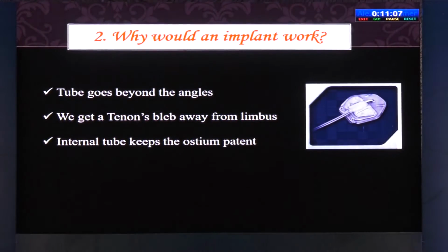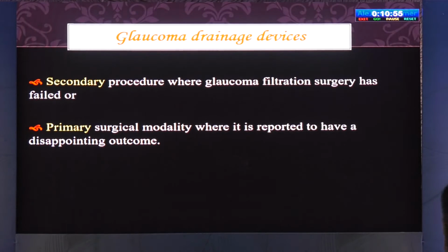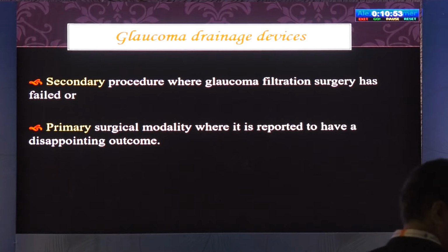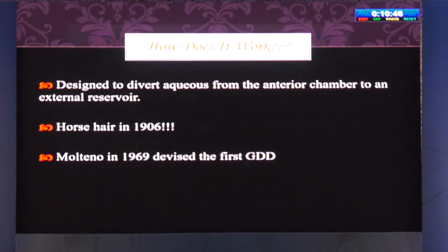Why would an implant work in such situations? It's because the tube goes beyond the angles. We get a Tenon's bleb away from the limbus, and the internal tube keeps the ostium open. GDDs can be used as a secondary procedure where GFS has already failed, or as a primary surgical modality where trabeculectomy is reported to have a disappointing outcome.